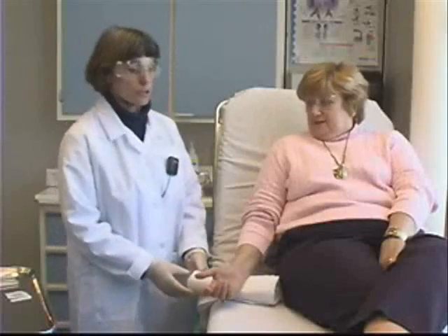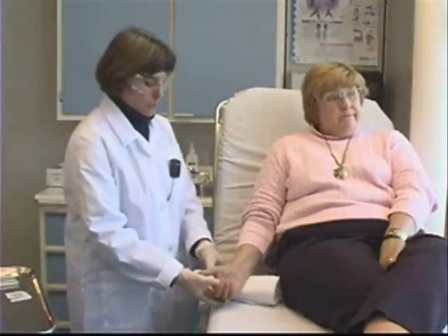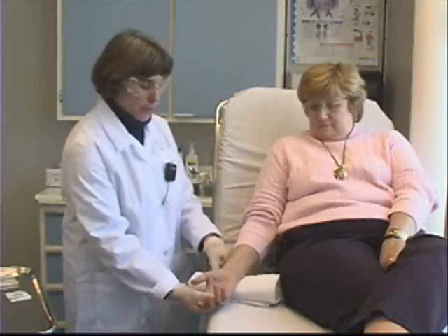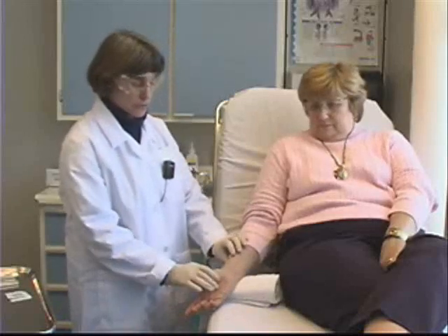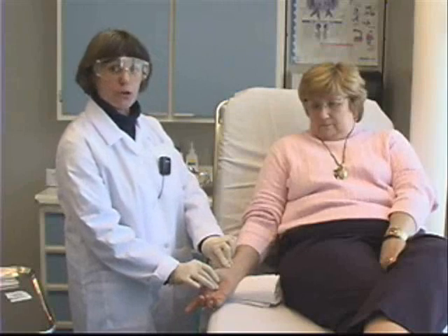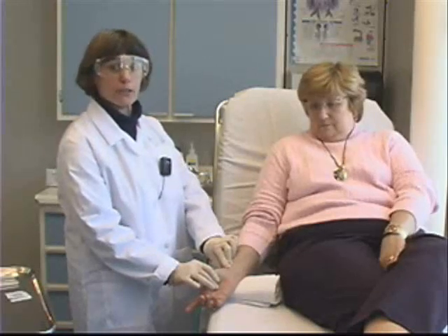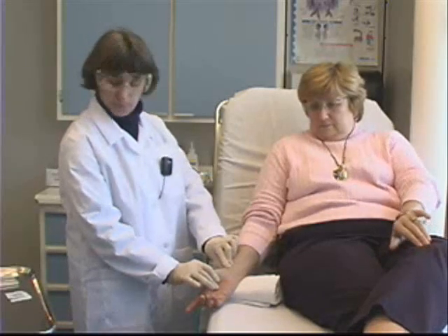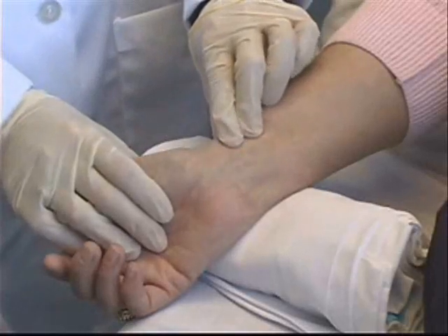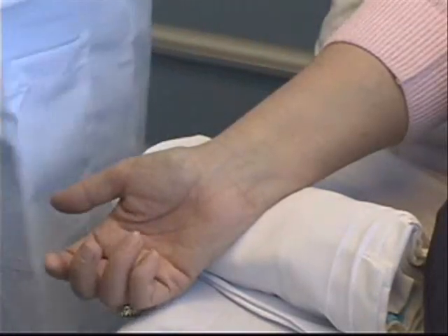I now have my patient seated comfortably on the stretcher. I'm going to tuck a rolled-up towel underneath her wrist. That will help hyperextend the wrist a little bit, which will bring the artery closer to the surface and make it easier to palpate. I'm going to feel for the artery again — that's right there.